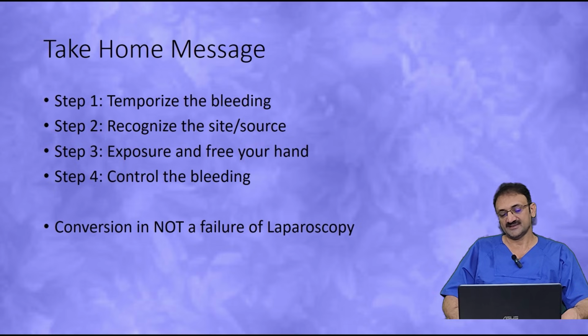Temporarily control it. And I already mentioned that conversion in laparoscopy is not considered to be a failure of laparoscopy, but it is for the safety of the patient. So always and always keep your ego away from the operation theater.